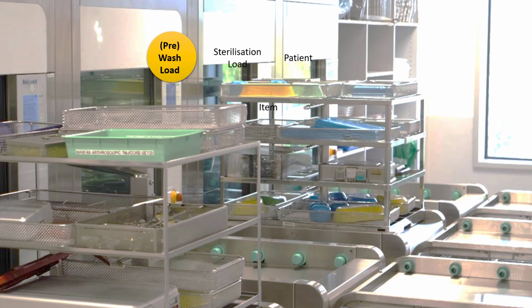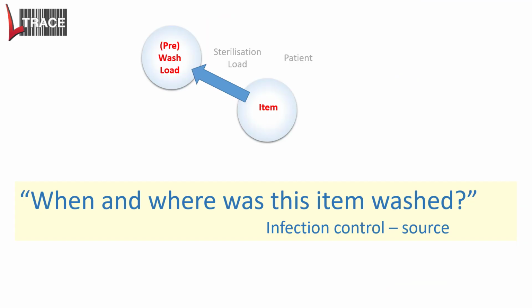Now let's have a look at what happens when we incorporate the wash load with our tracking system. When and where was this item washed? Which is fantastic for infection control. And one could actually argue that the wash cycle is probably more important than the sterilisation cycle. The logic behind that is you can't sterilise a dirty item. So if it hasn't been washed effectively, it doesn't matter what you're going to do through the sterilisation, you need to make sure that it's been properly washed first.